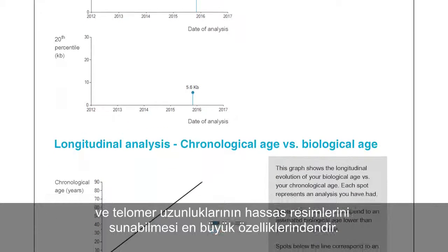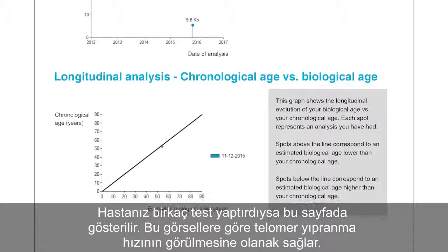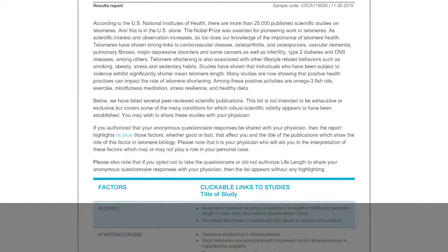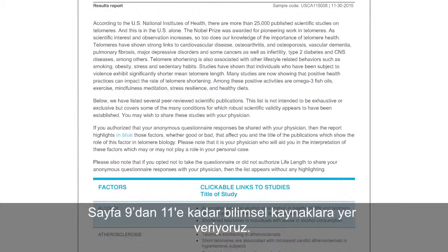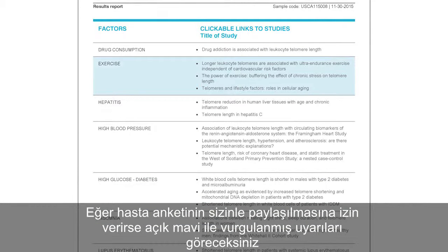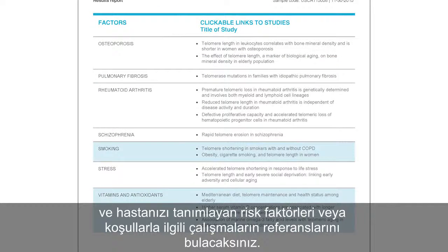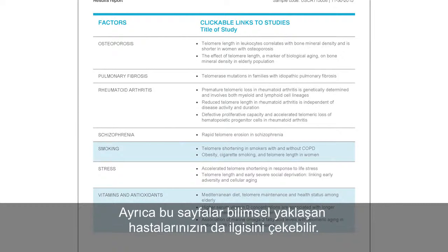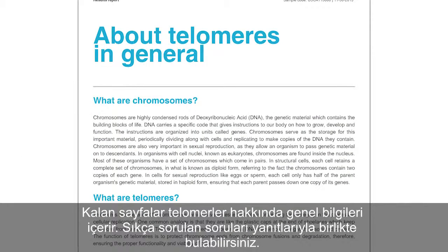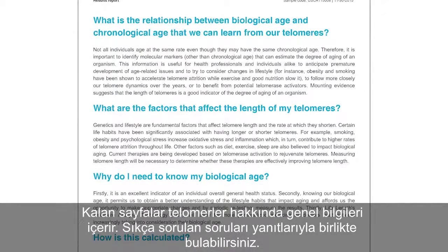If your patient has had several tests, these will be shown on this page, allowing for a visual representation of the rate of telomere attrition. On pages 9 through 11, we've included scientific references. If the patient authorized that their questionnaire be shared with you, you'll find alerts highlighted in light blue and references to studies that specifically relate to risk factors or conditions that your patient described. Alternatively, these pages may just be of interest to scientifically minded patients. Finally, on the remaining pages is general information about telomeres, including responses to the most frequent questions you may be asked.